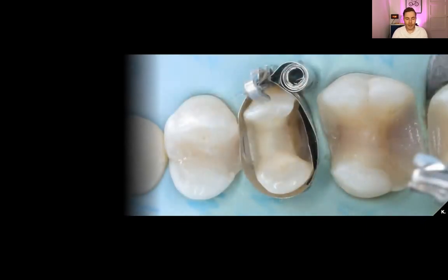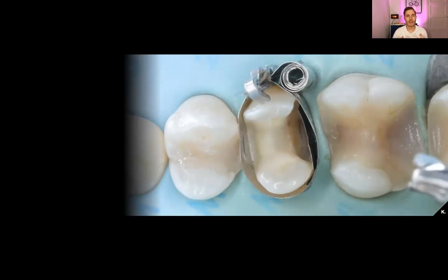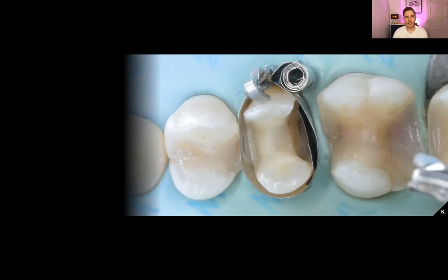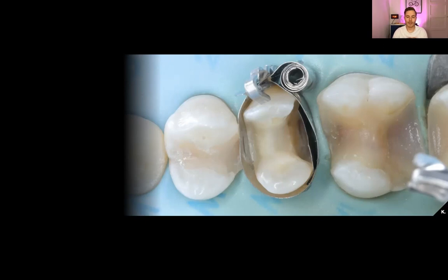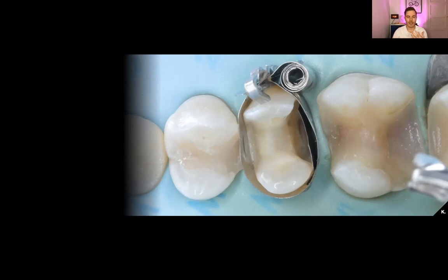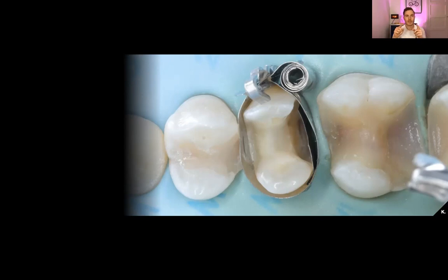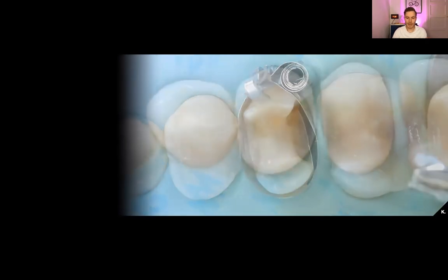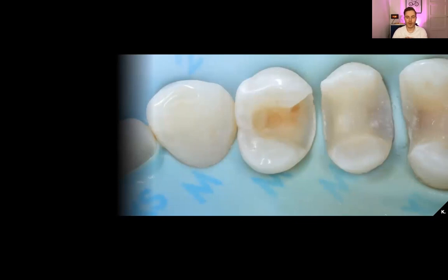Then I decided I had enough time to also go to the second premolar. I removed the entire restoration there and repeated the same process. As you can see on this slide, I also cut my matrix band a little bit because it was too long to push in between my auto matrix and the tooth. I cut the rounded parts off so I could slide it in between, repeated the same process, and then went on to the first premolar.